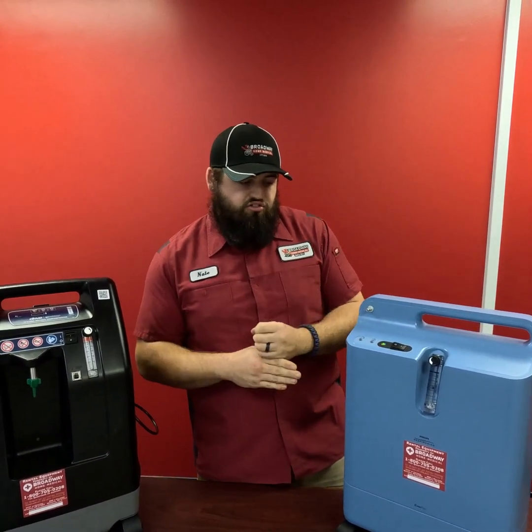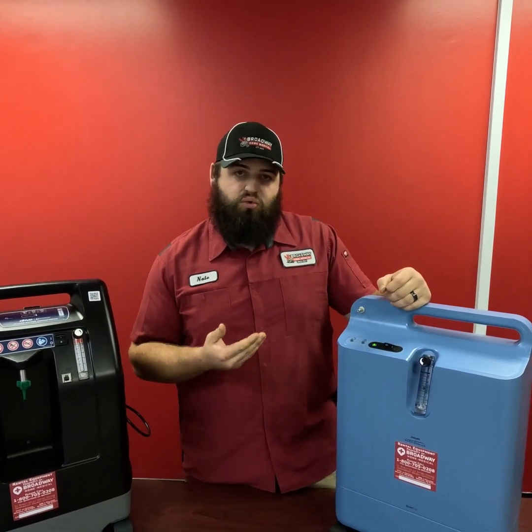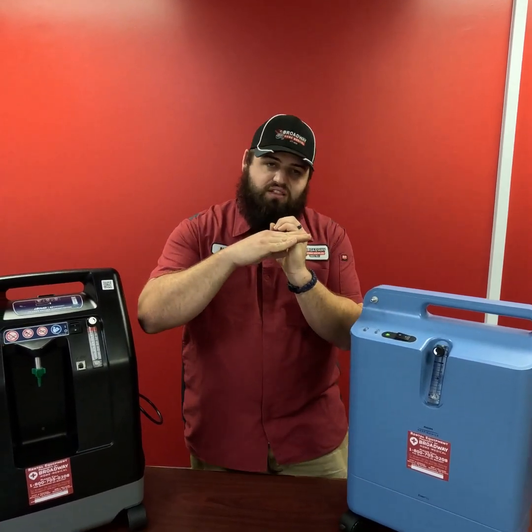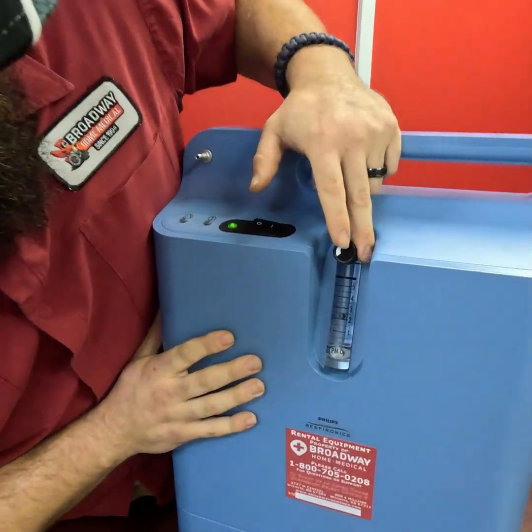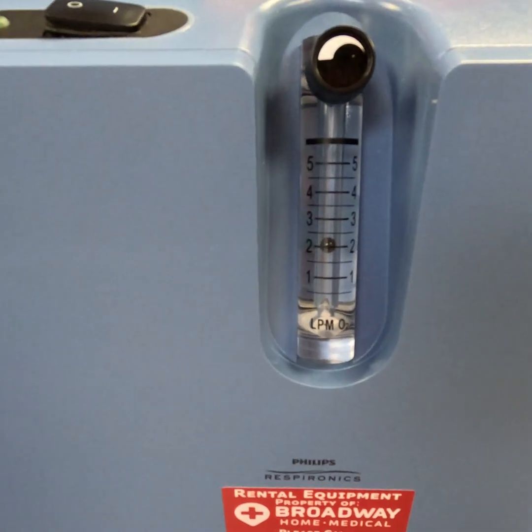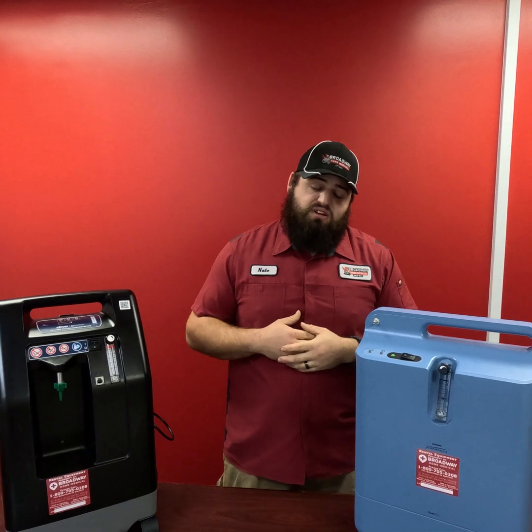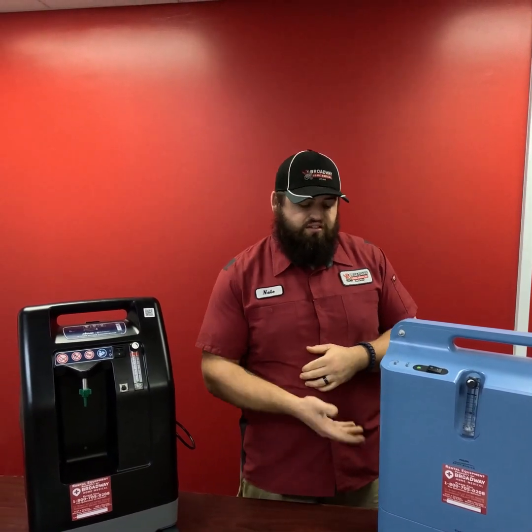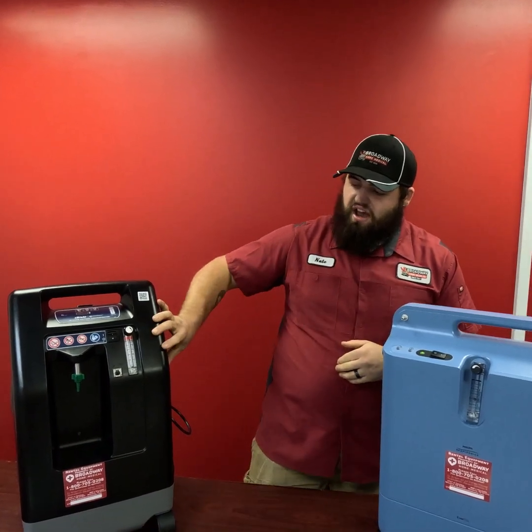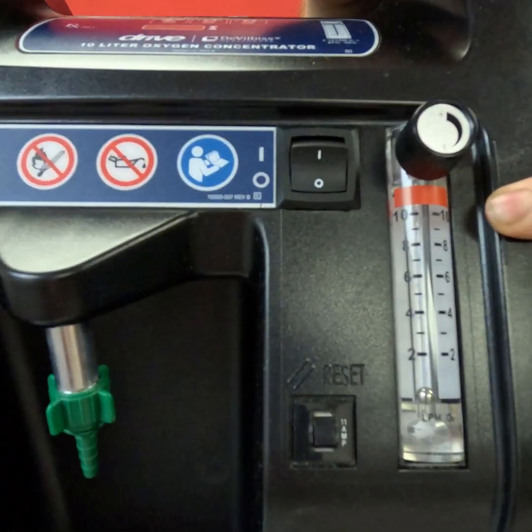Now, according to our training, whenever we're setting up one of these machines, we like to set up to where the ball is split by the line right in the center. So if I were setting up for 2 liters of oxygen a minute, it should look something like that. Right now this machine is pumping out 2 liters of oxygen a minute, which is a pretty standard liter flow amongst most people. Now we do have a higher liter flow. This machine here will go up to 10 liters of oxygen a minute.